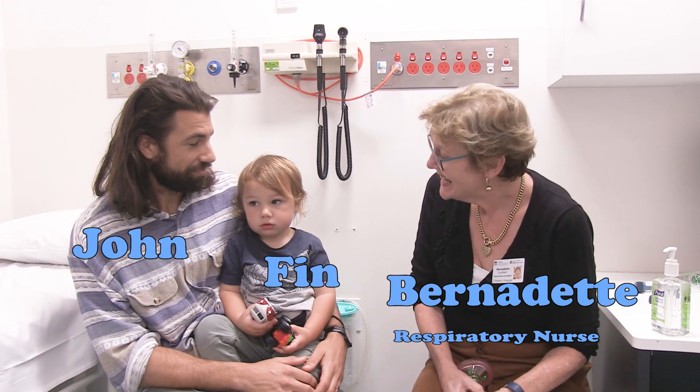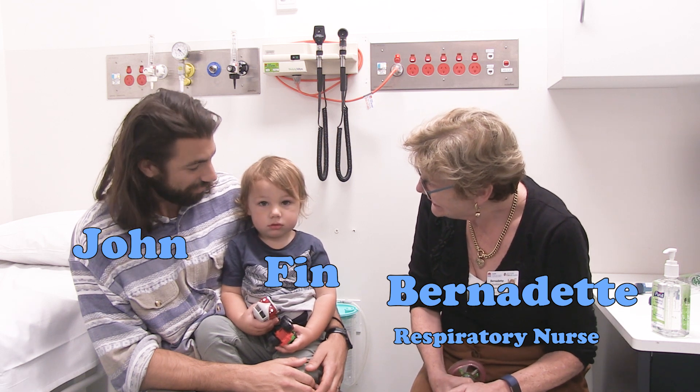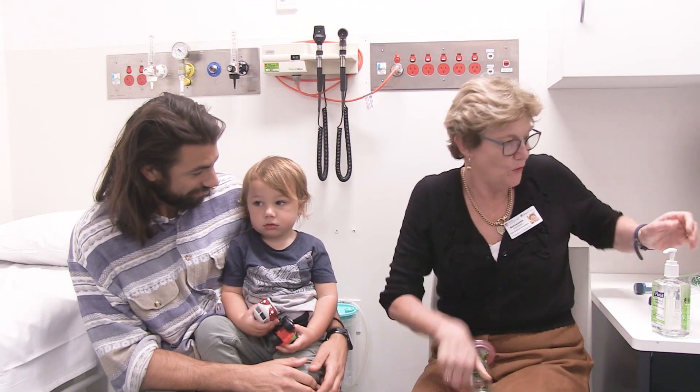Hi John, I'm Bernadette and I'm the asthma nurse. Finn's here today and I'm going to show you how to use your puffer. Do you know how to use your puffer? I think you've used it before.